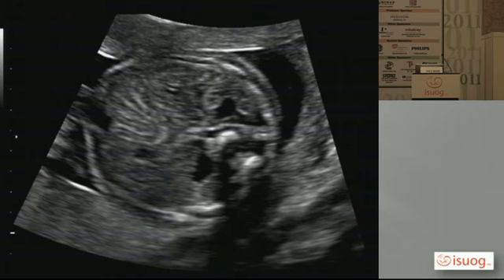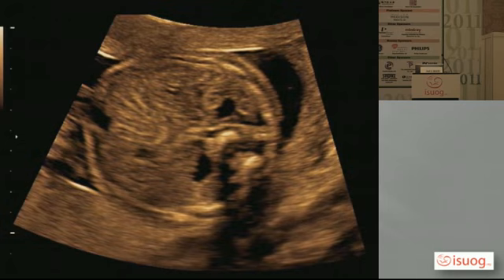This illustrates the difference between using the cones and rods of your eye. Notice that when the sepia image is on the screen, your eye muscles relax, and when the gray image is on the screen, your eye muscles contract. This suggests to me that there is less eye strain when the sepia image is displayed than when observing the grayscale image. For this reason, I usually scan using sepia. Now watch the image and see if you experience the same change in eye muscle contraction and relaxation that I have observed.